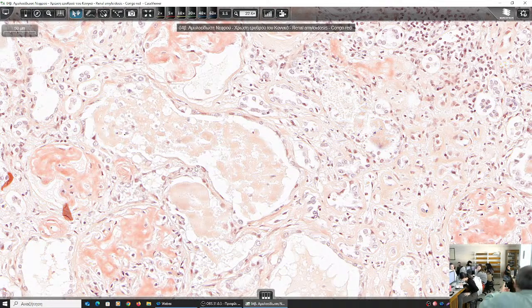It's very simple. All urinary tubules expect to get blood from what leaves the glomerulus. They do not have a separate blood supply. You remember, this is the afferent and the efferent arteriole. So if the glomerulus no longer functions because it has been destroyed by amyloidosis, there is no blood coming out of the glomerulus to give oxygen and blood supply to the tubules.